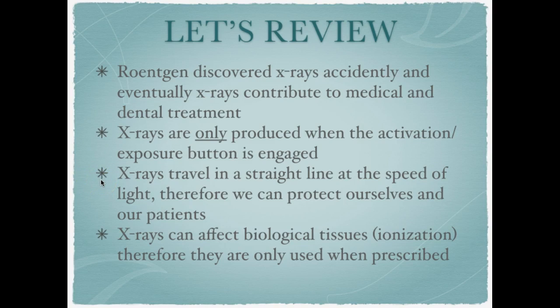Therefore, we can protect ourselves and our patients. X-rays do affect biological tissue in the process known as ionization. Therefore, they should only be used when prescribed. That concludes the history and production of X-rays, and thank you very much for your attention.